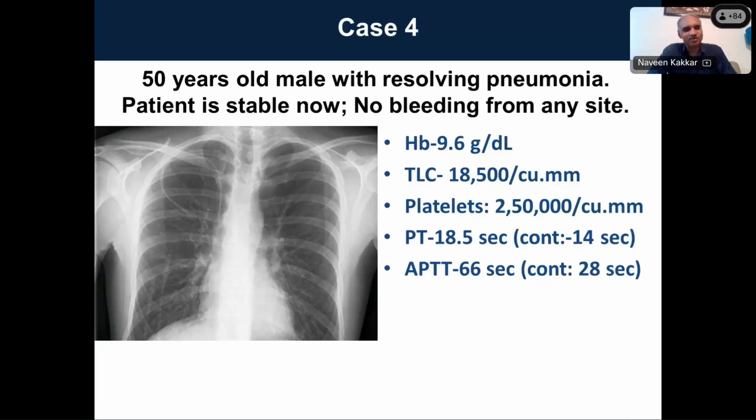Okay, I'll give you a clue. There is something in the right lung field that can help you. The right lung field. So NG. Something else? NGT would be more central. That, yes. So there. So this is a central line. Central line. Yes, sir. Right. So now can you think of the answer to this case?